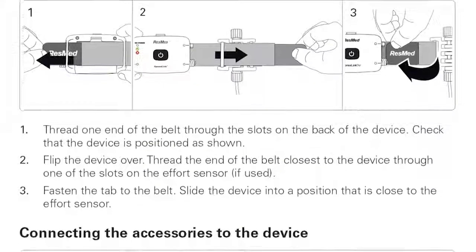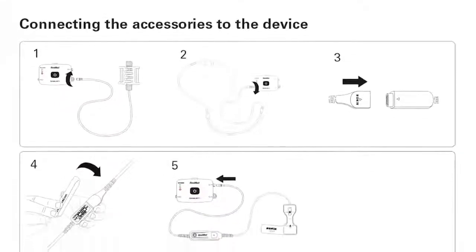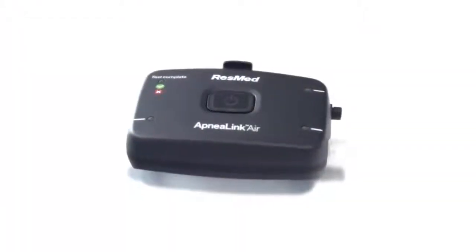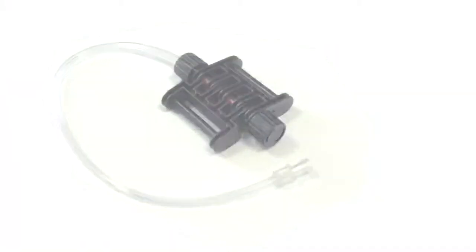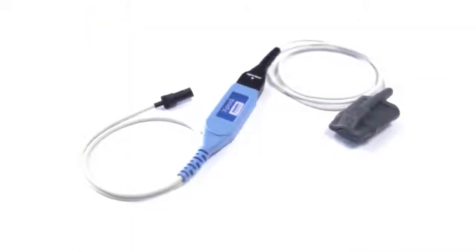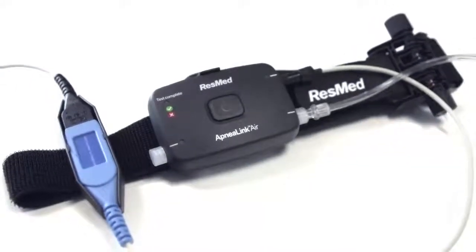At any time in the setup, you can also refer to the patient instructions provided by your clinician to get further details. When you open the pack, you find several components: the ApneaLink Air Recorder, the belt, its effort sensor, the nasal cannula, and the pulse oximeter. We'll explain each of these parts as we assemble the system.